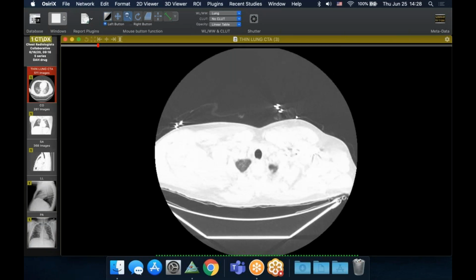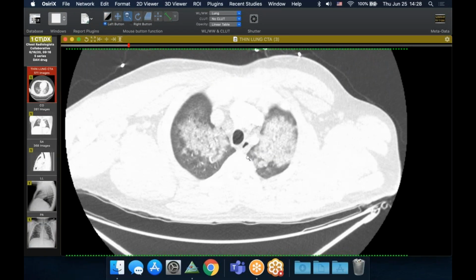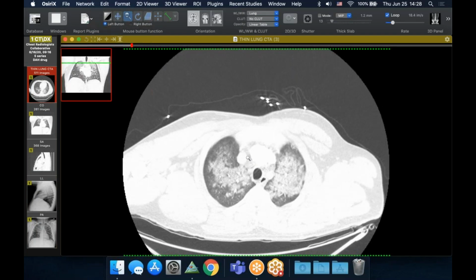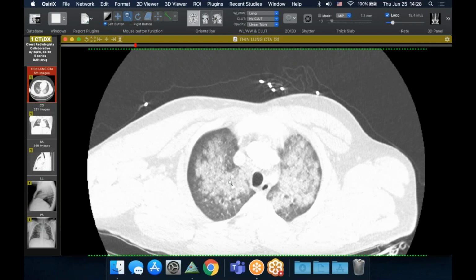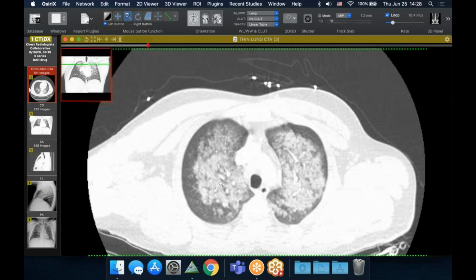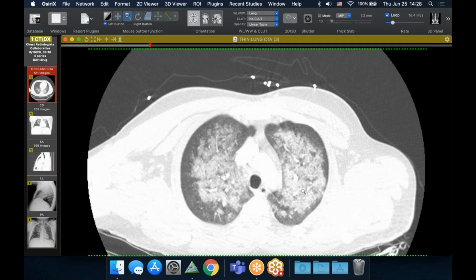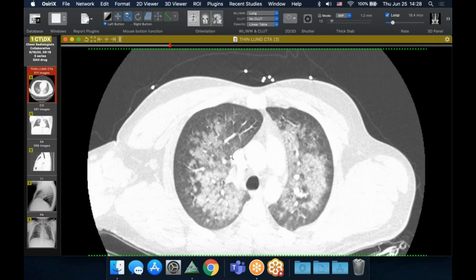And here's his chest CT. You can see really nice, and I showed a case of pulmonary hemorrhage last week, but really nice acinar type nodules filling the whole lobule with sparing of just the periphery there. So you see the black lines around the vessels. So a good look for pulmonary hemorrhage in the right setting. Even some suggestion it's sort of crazy paving-ish.